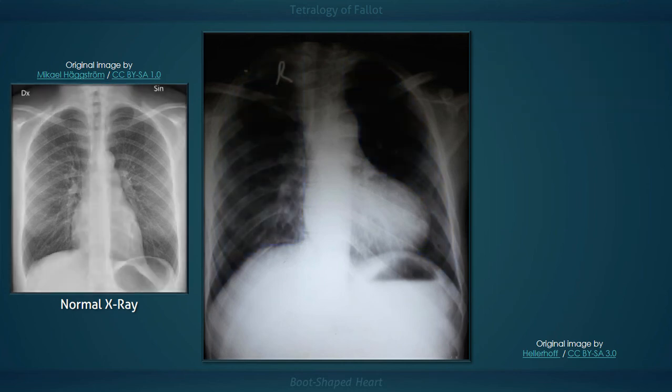Now for a quick review. The four findings in this radiograph of a boot-shaped heart include an upturned cardiac apex, a concave main pulmonary artery segment, and an enlarged aorta.